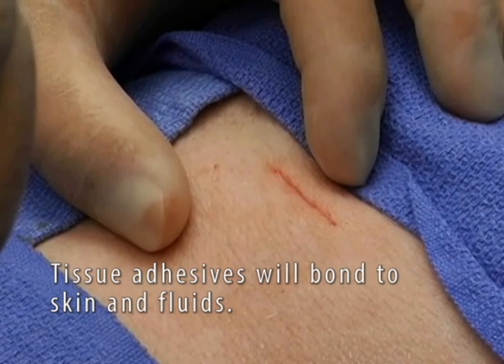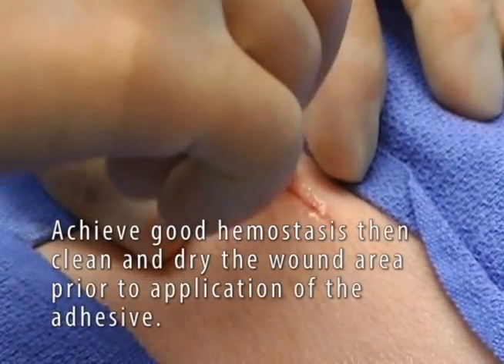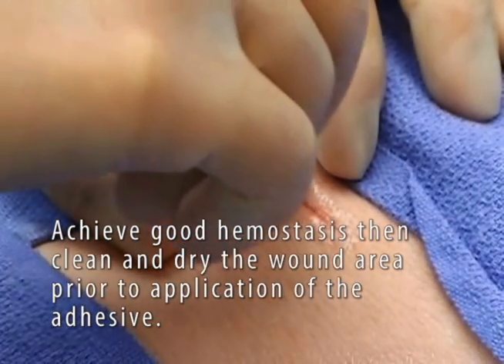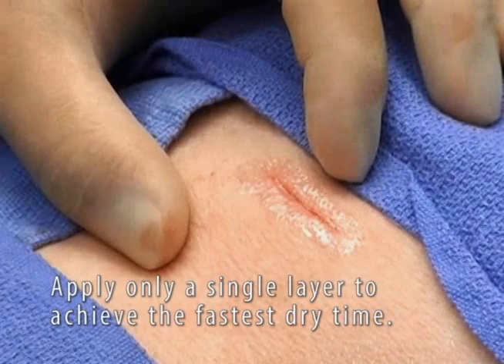An important fact about tissue adhesives is they will bond to skin and fluids. If blood is present, it will bond to the blood, not the skin. So it is important to get good hemostasis. Clean and dry the wound area prior to application of the Dermaflex QS adhesive.